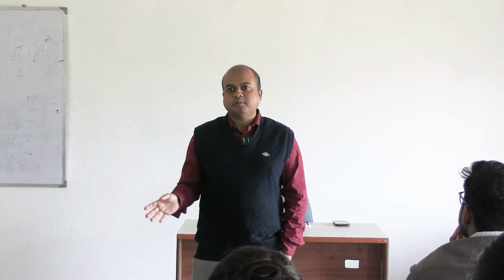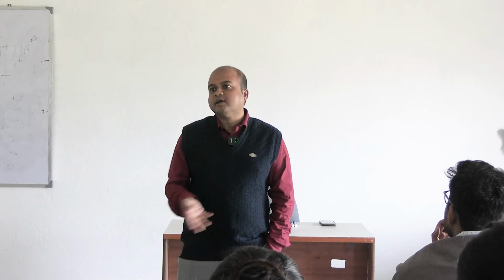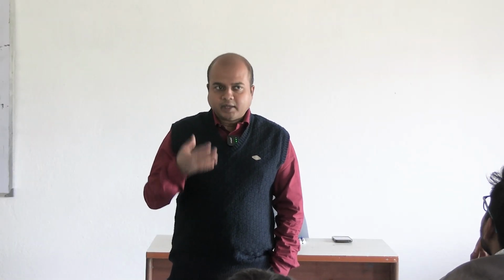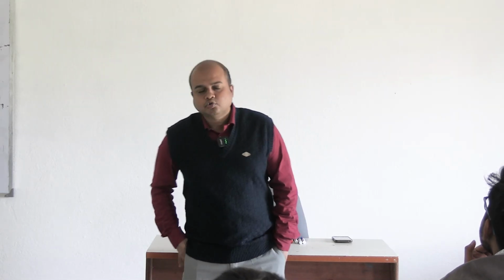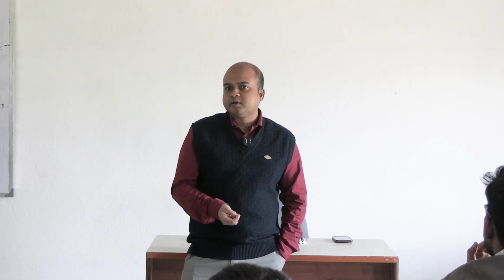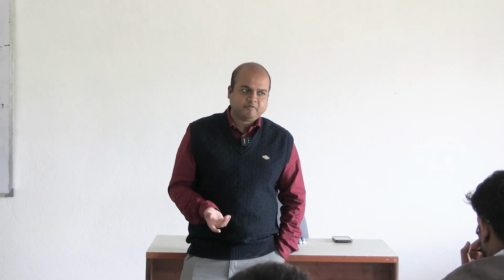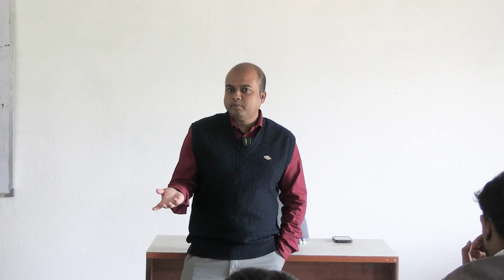Size of the bulb in the RBC pipette is much greater, approximately 8 to 10 times, but it can be made out with the naked eye. So that is the main point to be mentioned when the examiner asks you how do you identify the RBC pipette. Another is the marking 101. Again, the marking also may fade out. So without these points the dilution factor will be varied.